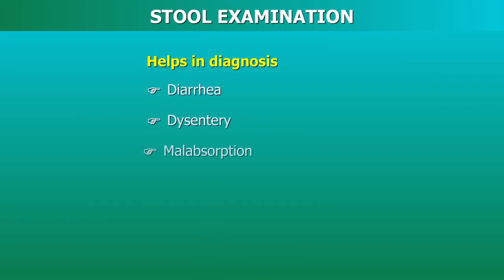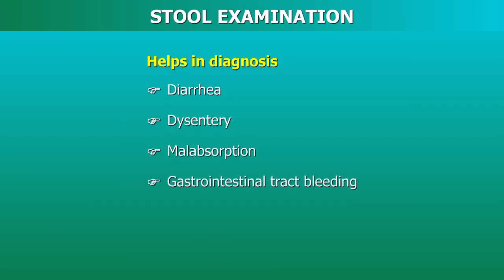Stool examination. Stool examination is carried out in laboratories for various diagnostic purposes. Stool routine test helps in the diagnosis of diarrhea, dysentery, malabsorption, gastrointestinal tract bleeding, and parasitic infections.